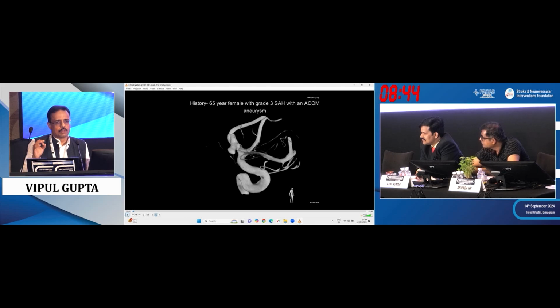One has to, as Professor Vincent mentioned, consider where each lobule is, how you're going to shape, how you're going to point. We like to catheterize them without wire in all these small aneurysm patients. The balloon need not always be overinflated. It's partial inflation, no inflation. All of this is important. And we change our micro. You don't use the same micro because they lose their integrity. Be open to using a new microcatheter to get a perfect shape in. Like we use a simple J, we use a perpendicular shape and a reverse shape for the 3 lobules in this patient.